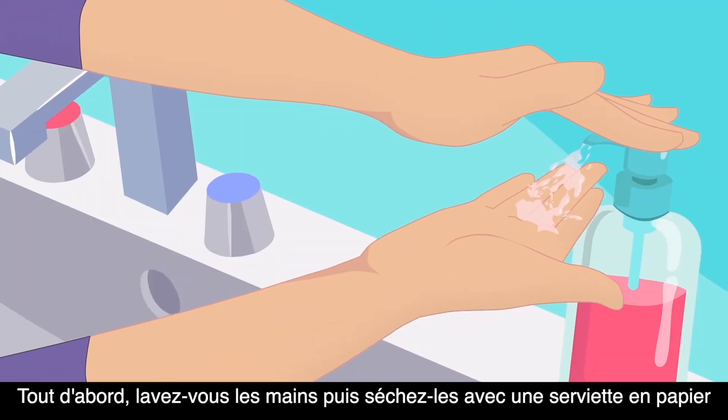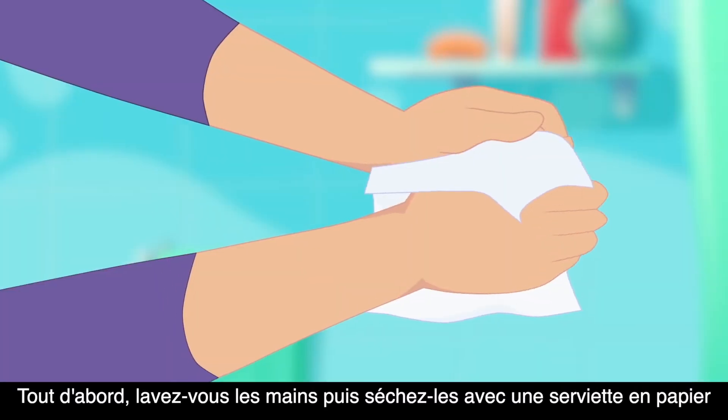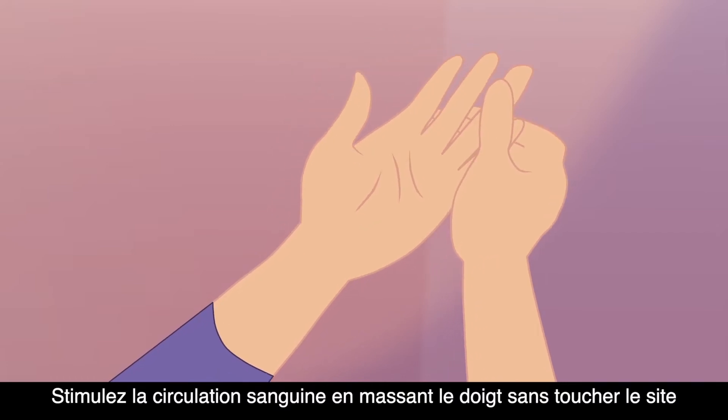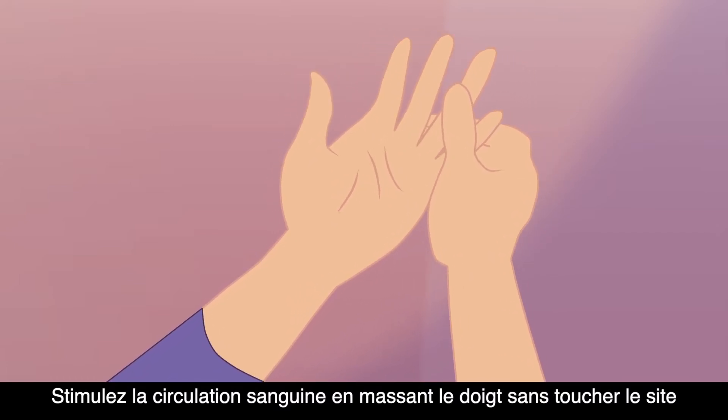First, wash your hands then dry them with a paper towel. Stimulate blood flow by massaging the finger without touching the puncture site.